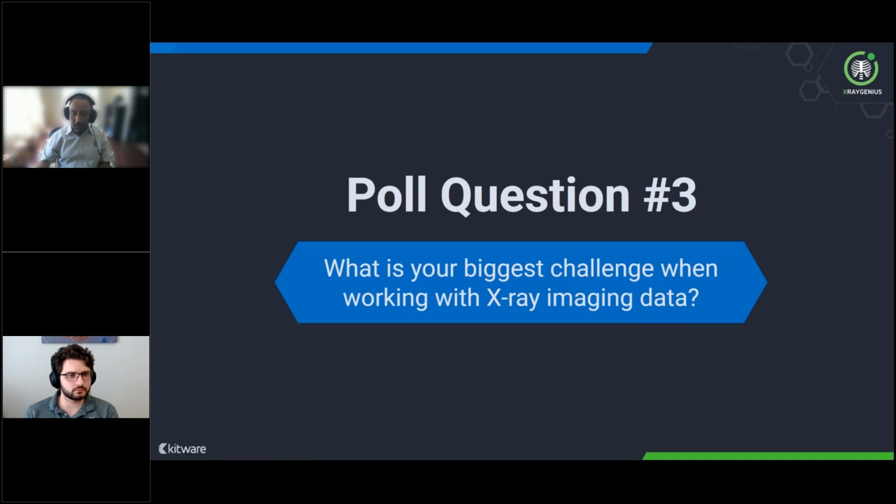All right, excellent. Not surprisingly, almost all of you indicated that there's limited availability of annotated data sets, and being able to simulate different real-world variations. And as we will show very soon, X-Ray Genius is designed to be able to generate a lot of batch X-ray images with different conditions. So thank you for participating there.